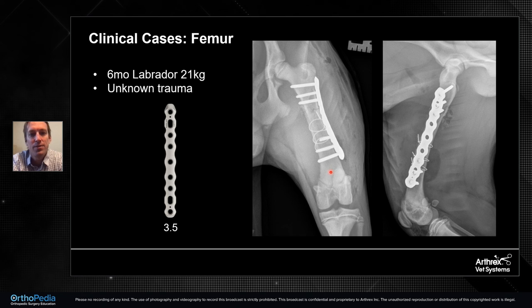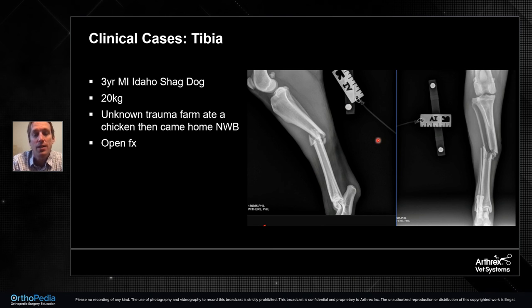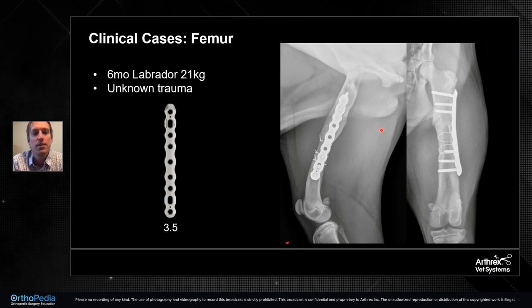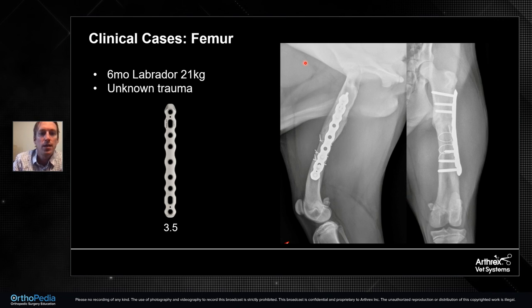And so there's the post-operative repair, and you saw again how proximal that fracture was. The surgeon chose not to go over the trochanter apophysis in this case, just because of this dog being young and still having some trochanter growth. So this is radiographs at, I believe, 6 weeks, just showing that callus formation, bridging certainly on the lateral view, and no major shifting of the implants.